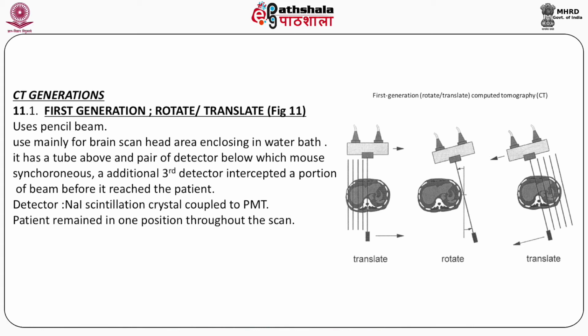In this case you can see here the first generation CT scanner, a pencil beam is used and the X-ray beam is translated from a particular angle.